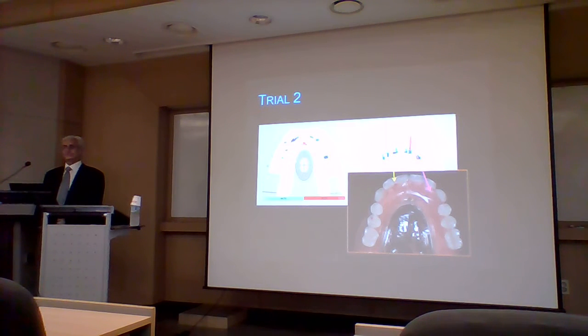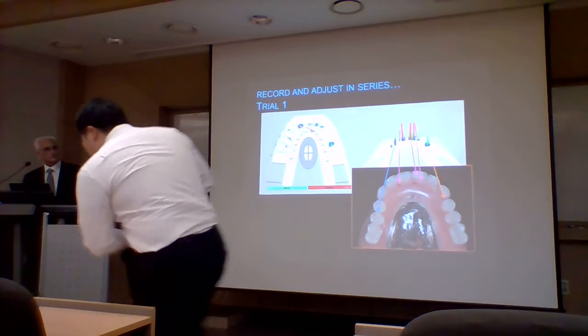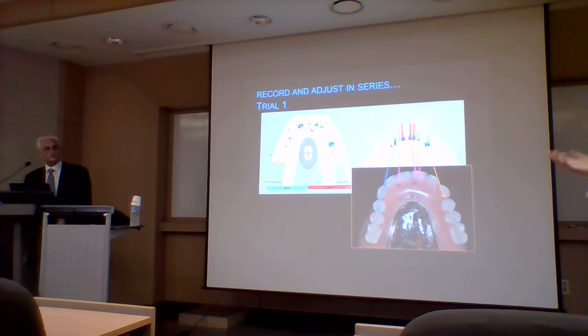여러분들 리무버블 집어넣을 때도 보면 이제 내면의 핏에 대한 걸 많이 얘기하지만, 세미나 시간에도 얘기하는 것들이 교합을 안정시키는 것이 굉장히 필요한데, 아까 본 것처럼 티스캔과 교합지를 잘 조합하고, 리무버블처럼 한두 개의 자연치아가 있는 경우에 힘을 균형되도록 하기 위해서는 딜리버리하는 날 시간이 오래 걸릴 수밖에 없는 거죠. 그 시간을 줄이려고 대충 맞춰주고 써보시면 아픈 데 드러날 거라고 얘기하는 것보다는, 이 분 얘기 들으니까 딜리버리하는 게 1시간 정도 걸린다고 하더라고요. 마킹하고 조정하고 또 티스캔 찍어보고 하다 보니까 시간이 걸리는 것이죠.